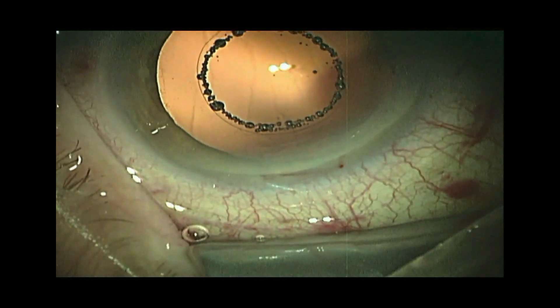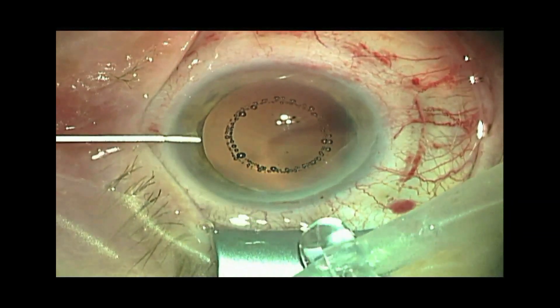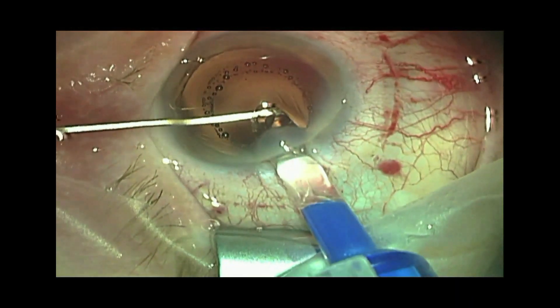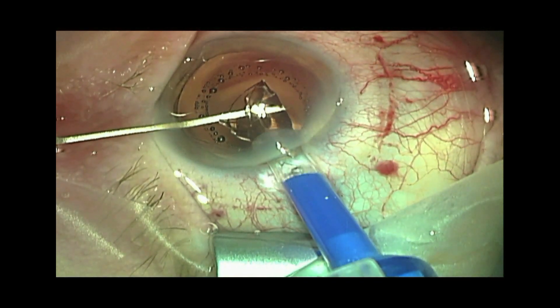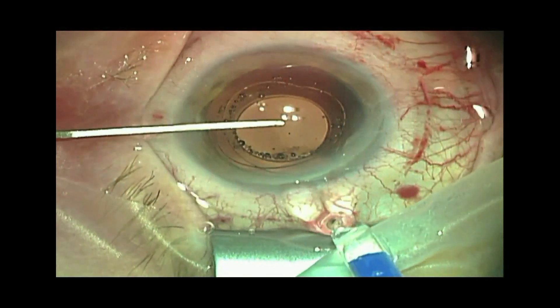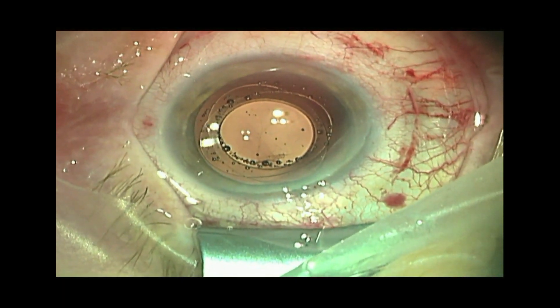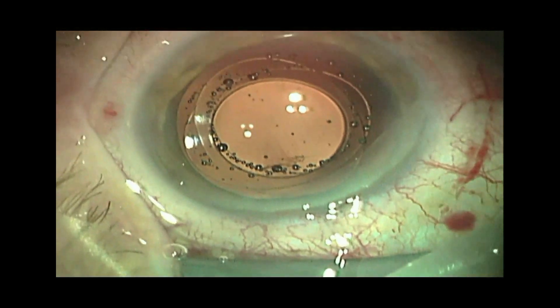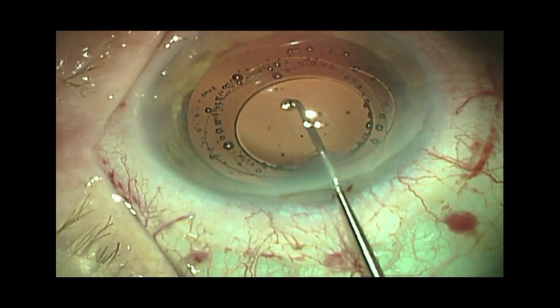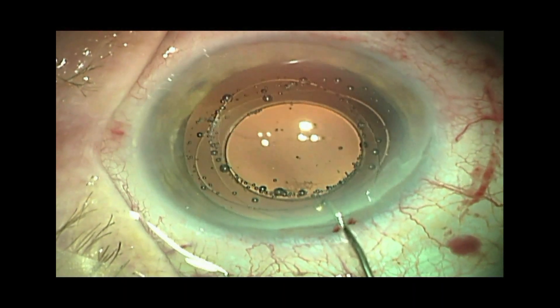The Tassignon Bag-in-the-Lens IOL Type 89A, which is a foldable hydrophilic lens, is loaded into a 2.8 mm cartridge and injected into the anterior chamber. The posterior haptics are placed behind the posterior capsule and the anterior haptics in front of the anterior capsule, keeping the anterior and posterior capsules captured within the IOL's flange.